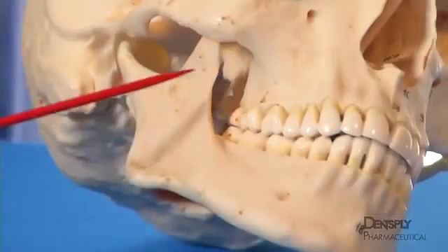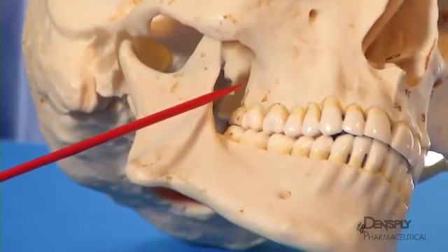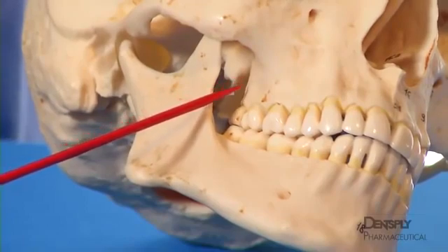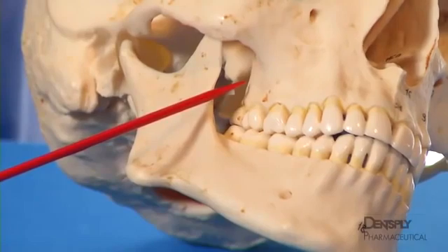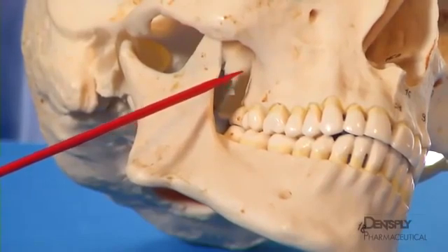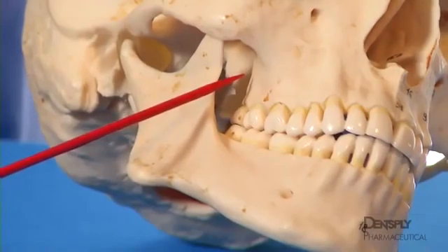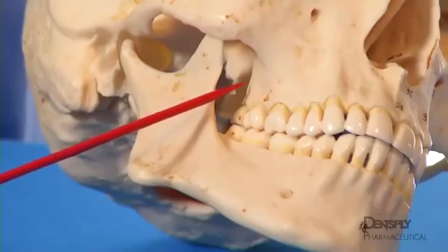The target site for the posterior superior alveolar nerve block lies on the posterior aspect of the maxilla, about 1 centimeter above and medial to the apices of the third molar. The nerve enters the maxilla here through one or more foramina. Because this area is convex, the needle must be oriented in a backward, upward, and inward direction.